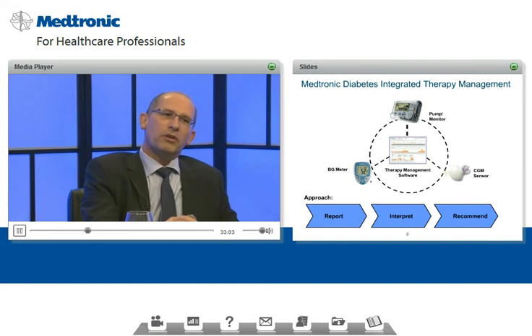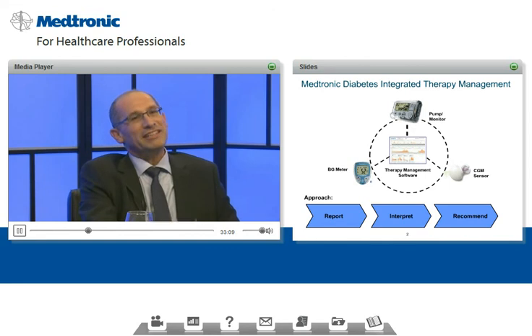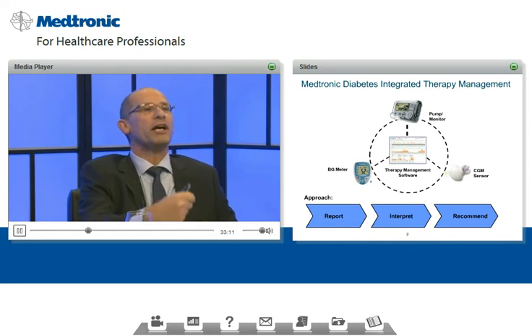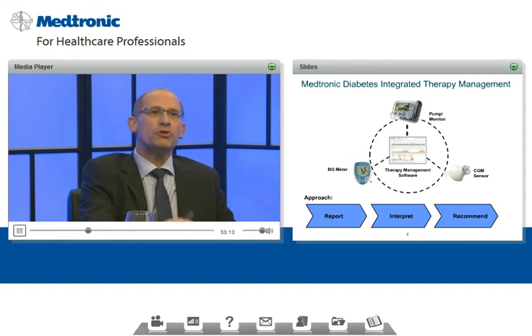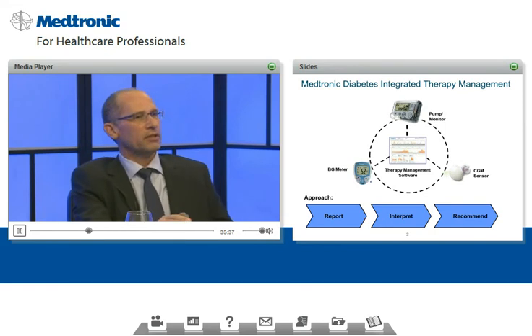Because while you're measuring and getting data on the blood glucose control from one side, you can have additional information by looking at the human factor, or how the patient himself uses this data in order to change the way that he is interacting. That is, how much is he bolusing, does he change his basal rate? This important interaction between the data and the human behavior is a crucial point in getting better results from using technology. Now, this integration is very difficult because there's a lot of data coming both from the sensing and from the pump.